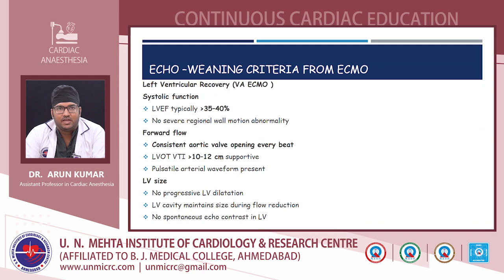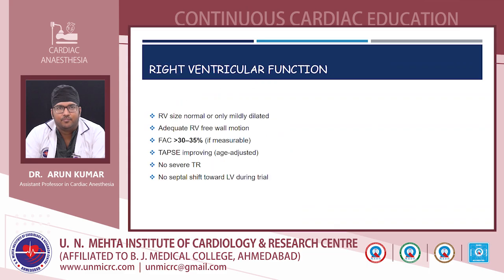LVOT VTI should be greater than 10 to 12 centimeters, and a pulsatile arterial waveform should be present. There should not be any progressive LV dilatation, LV cavity size should be maintained during flow reduction, and there should not be any spontaneous echo contrast in the LV.